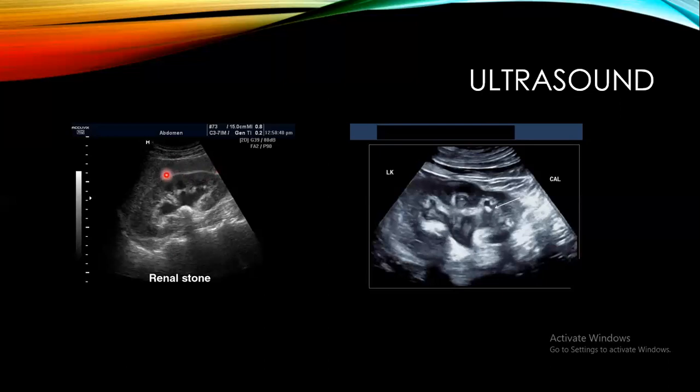انتوا لازم تعرفون اللون الأبيض منين دا يجي واللون الأسود منين دا يجي. اللون الأسود دا يجي إذا كانت الموجة الصوتية تمشي بسهولة بدون أي ارتدادات، واللون الأبيض يجي إذا كانت الموجة الصوتية تمشي بحواجز تضربها أو ارتدادات. بالنسبة للحواجز اللي تهمنا إحنا بالكدني، عندنا الحاجز الحلو اللي هو الحصوة.